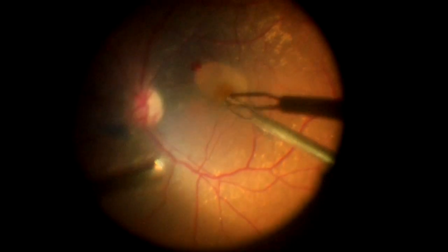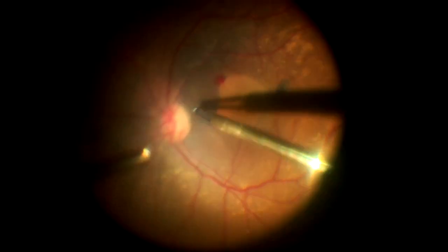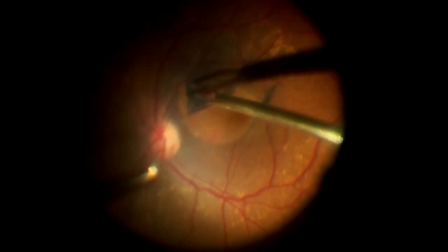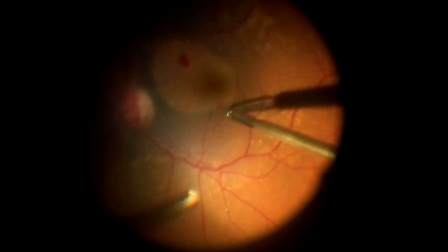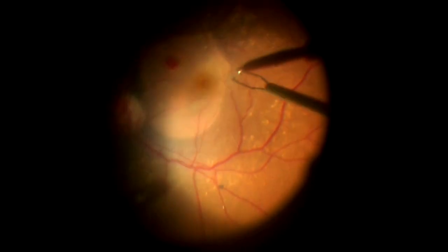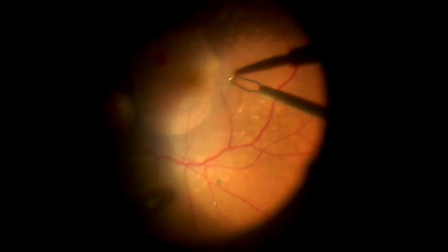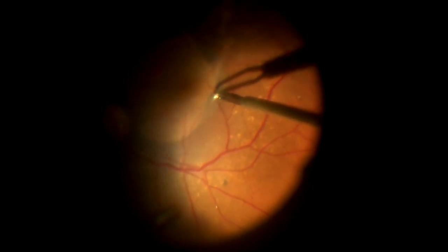This is a case in which you can control the ILM. You make a small opening, and then nasal ILM is much easier to remove and will come in a curvilinear fashion. But temporal ILM is more difficult. This is the nasal ILM. Temporal ILM is more difficult to remove because our leverage with our hands is also a little poorer. Probably you can use the other hand for the removal technique if you are ambidextrous.